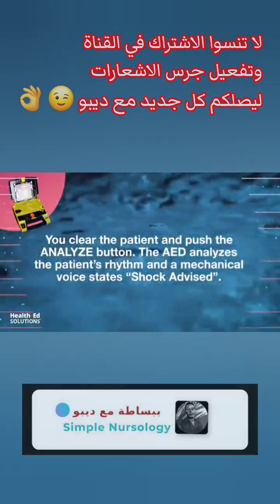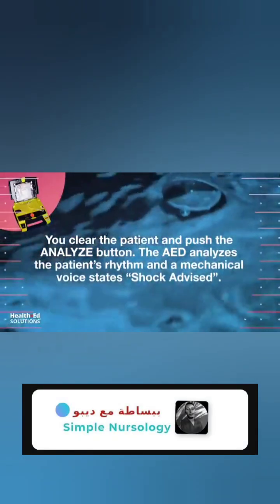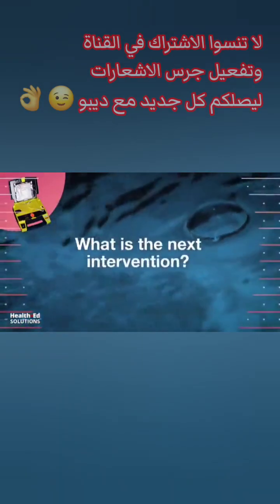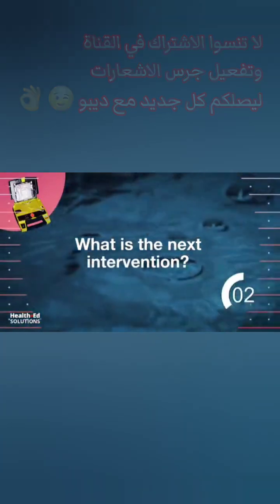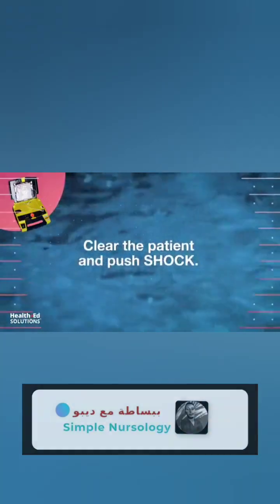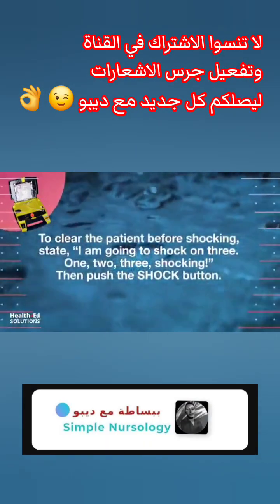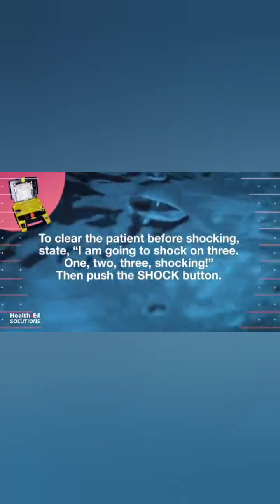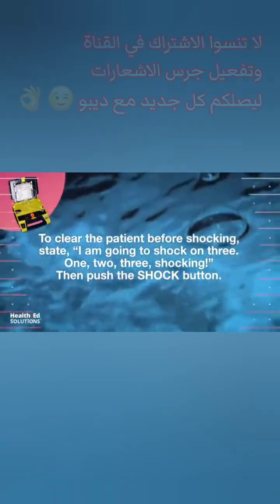The AED analyzes the patient's rhythm, and the mechanical voice states, "Shock advised." What is the next intervention? Clear the patient and push Shock. To clear the patient before shocking, state, "I am going to shock on 3. 1, 2, 3, shocking." Then push the Shock button.